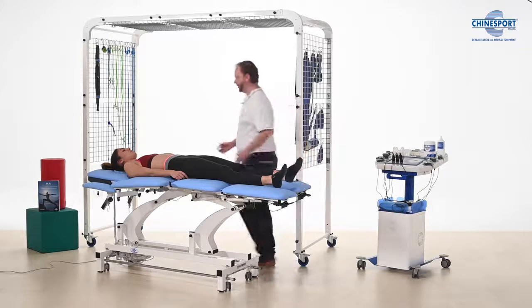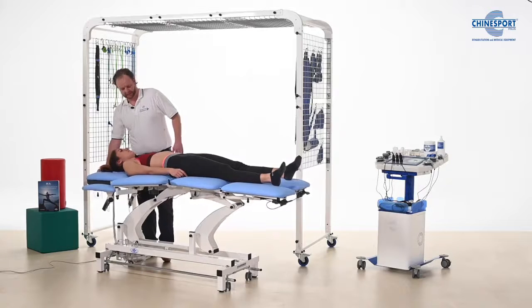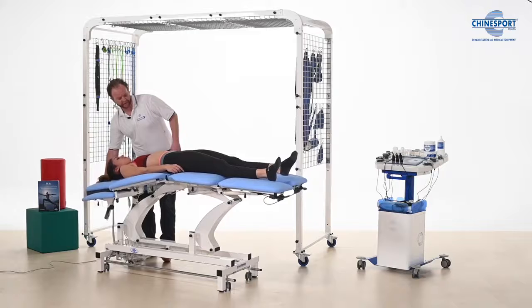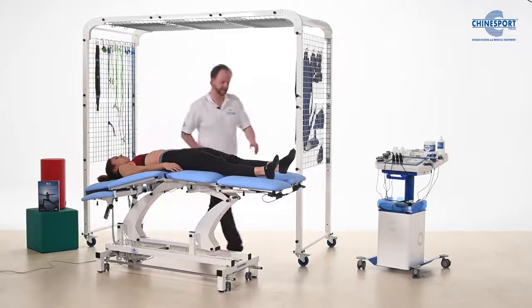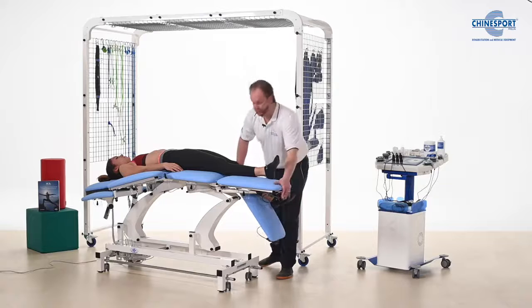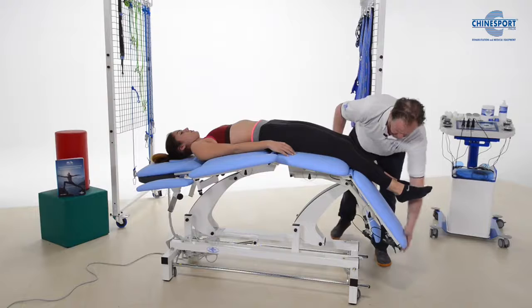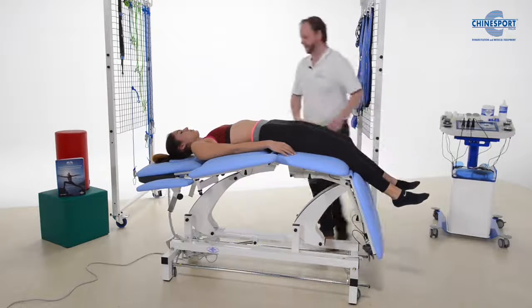Okay, and we can take our patient now as a final kind of exercise. We can go completely into extension just so you can see the extreme positions that we can achieve with the table.